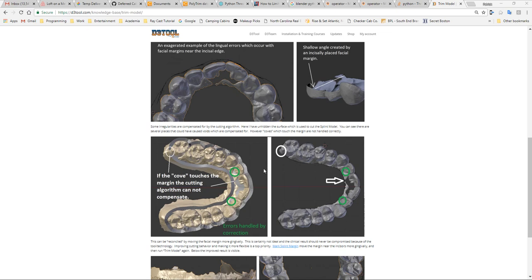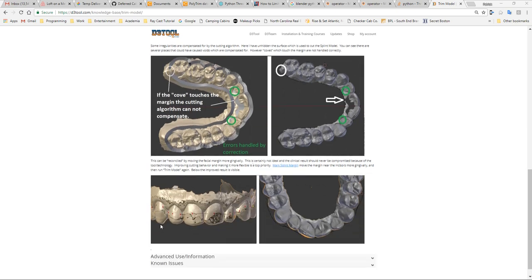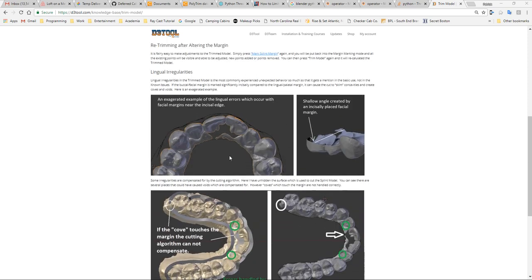Okay, just want to make a quick video and talk about what's been going on behind the scenes. What you're looking at here is the knowledge base page from the trim model function, and this is one of the biggest pain points in the workflow: you draw this line to mark your splint boundary, and sometimes you get exactly what you expect, and other times you get things that are crazy different. On top of that, it's kind of hard to see this line sometimes through the mesh.